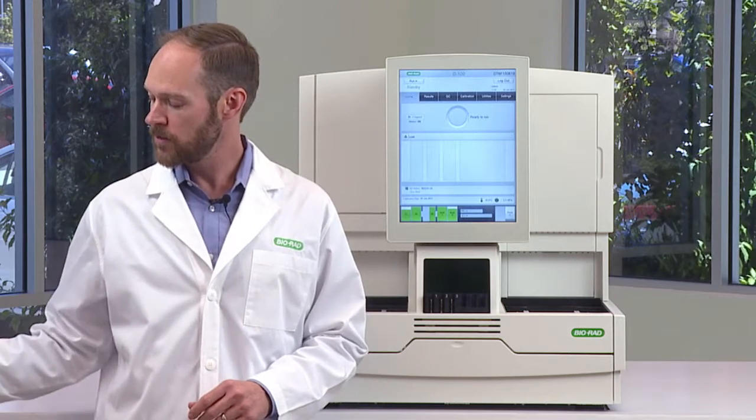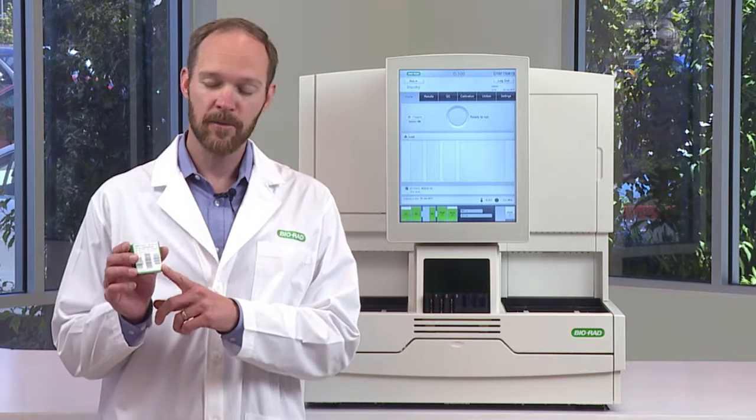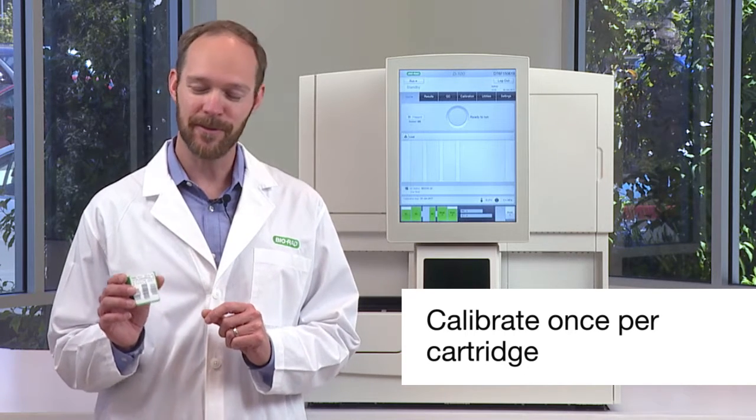Once you install the cartridge, you need to calibrate. Calibration is done using the calibrator pack. You only have to use this one time per cartridge, so again, not something you have to do very often.